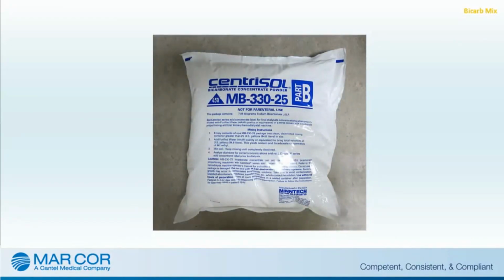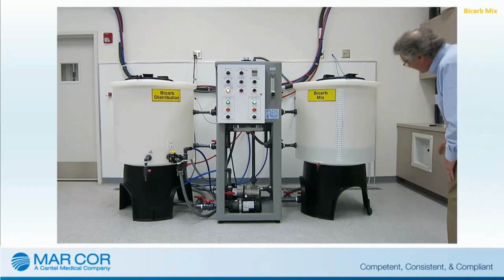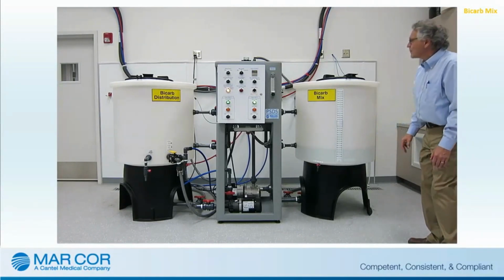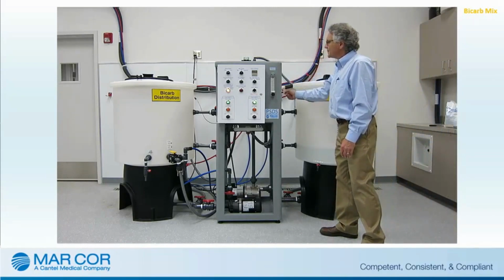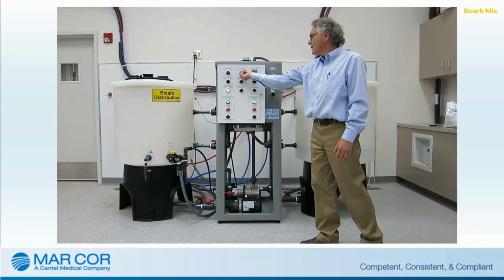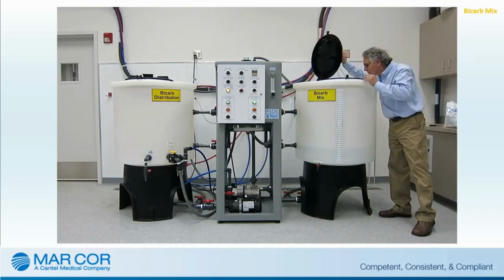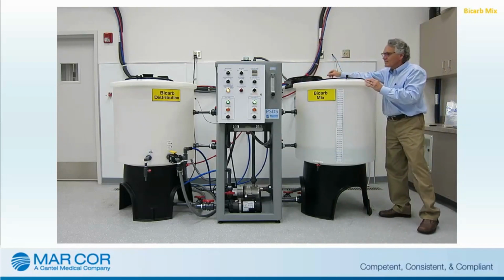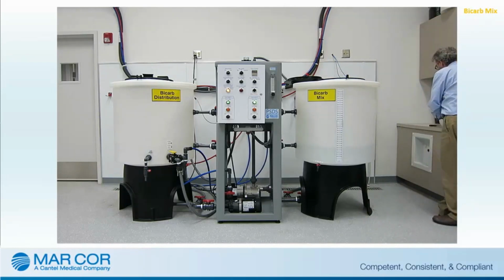Please read and follow all the bicarbonate powder manufacturer's instructions and labels regarding the preparation of bicarbonate solution before continuing with this procedure. Ensure the mix tank has been filled to the desired level and turn on the mix pump. Slowly add the appropriate amount of bicarb powder. Adding the powder to the water slowly will enable dissolving and mixing of the solution more efficiently.